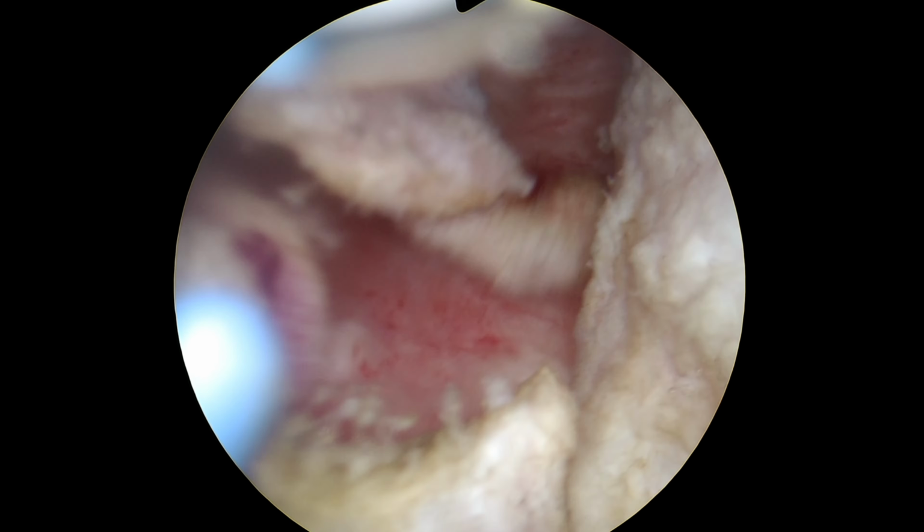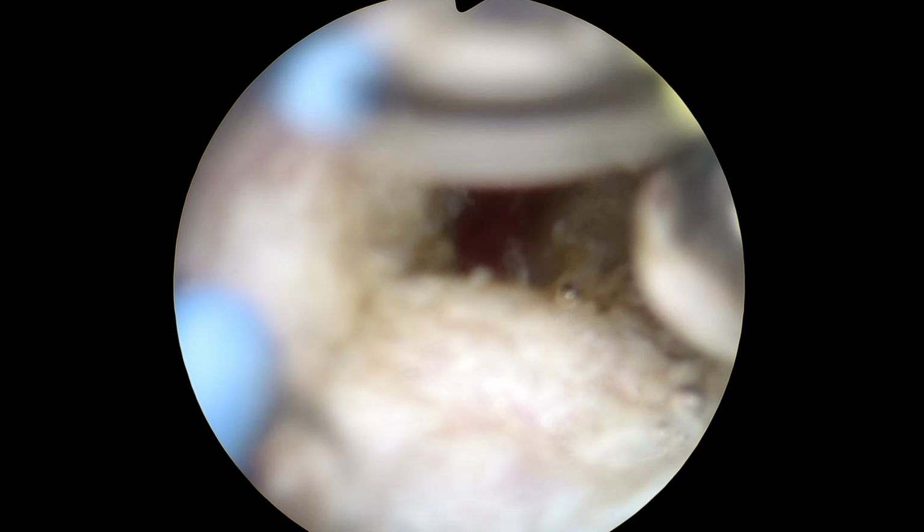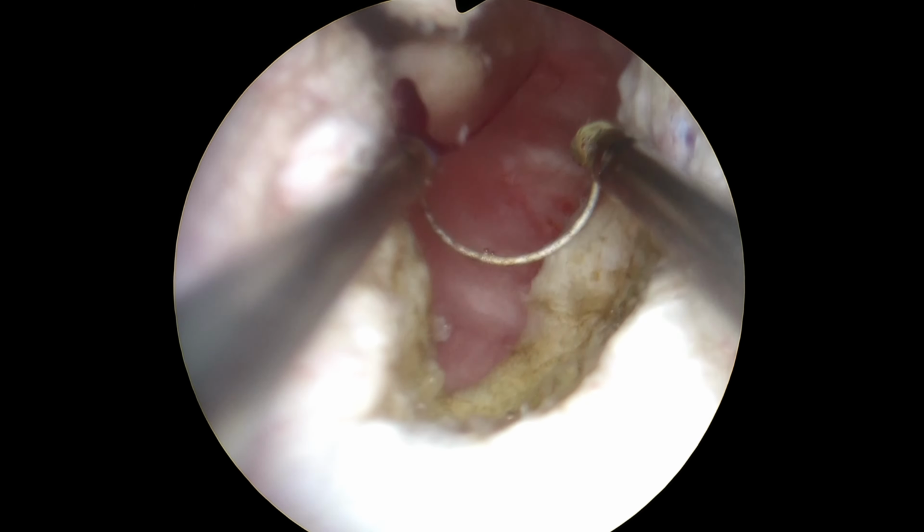Now the posterior wall of the uterus is visible, and it's our landmark now.